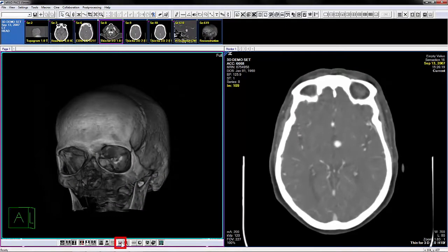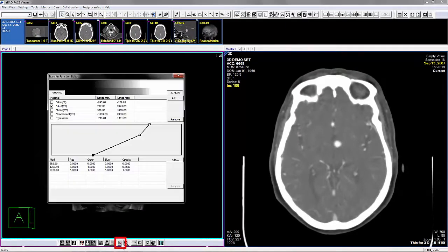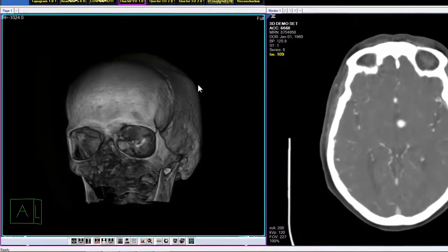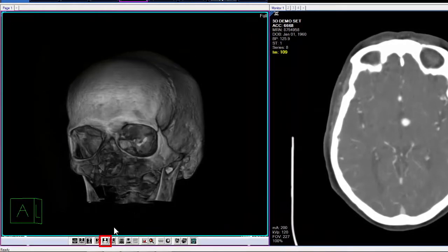You can also access the transfer function editor directly from the toolbar. Please refer to the manual for additional options and details.